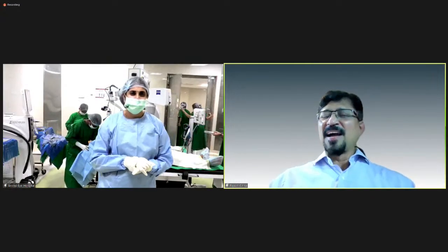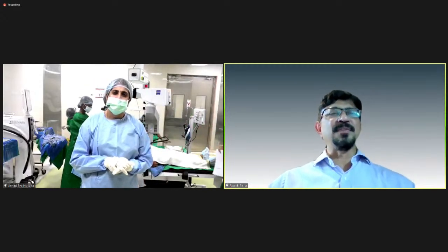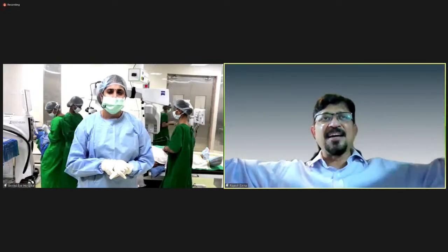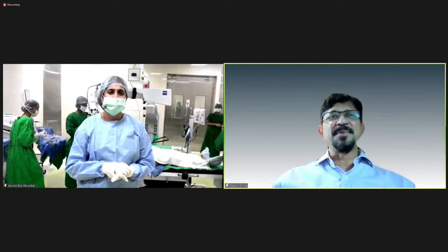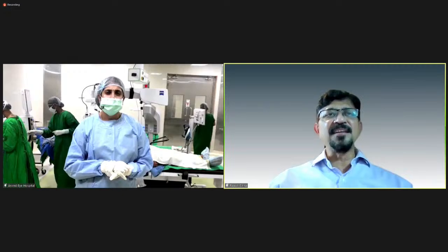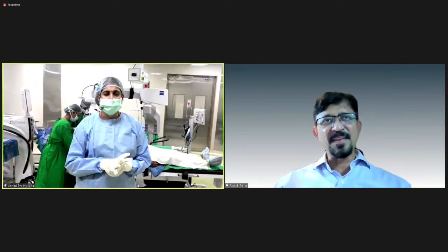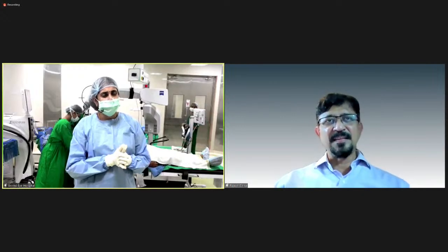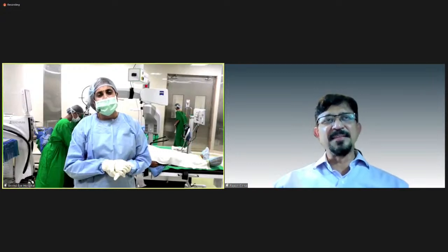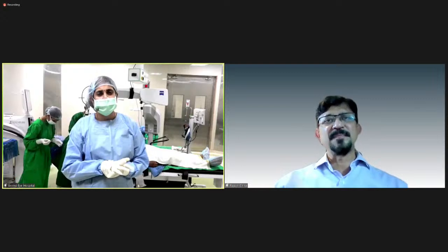There was one wonderful thing that you showed, that you lift the iris a little bit so that the iris doesn't get stuck and the AC doesn't become so deep, because it stretches the zonules. The patient has a feeling of pain and all that. It's a very good tip that you gave. Yeah. Once we do that, otherwise normally in myopes, we used to go ahead and change the parameters and all that. But today we use the same settings, and just with this one maneuver, things can be normal.